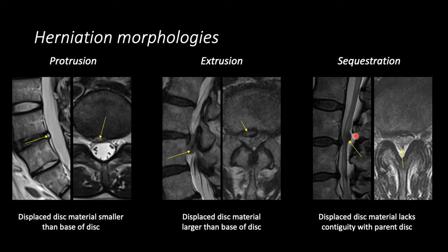Herniations can occur in different locations with respect to the spinal canal, best viewed on axial images. The central zone is situated between the medial margins of the facet joints. The subarticular zone, or lateral recess, is situated between the medial margin of the facet and the medial margin of the pedicle. The foramen is situated between the medial and lateral margins of the pedicle, and the extra-foraminal zone is lateral to the pedicle.